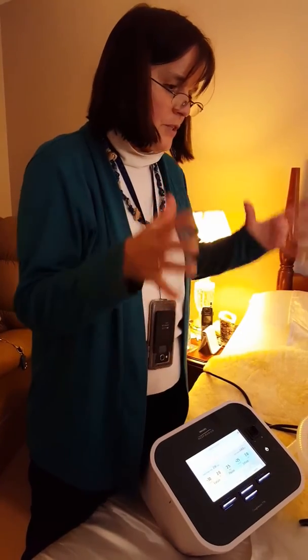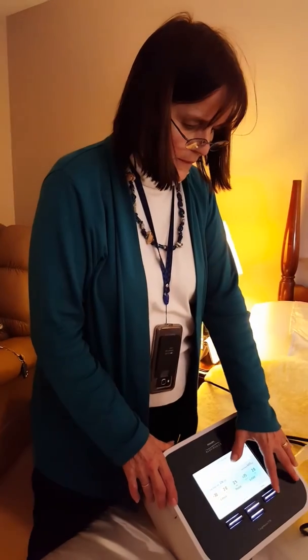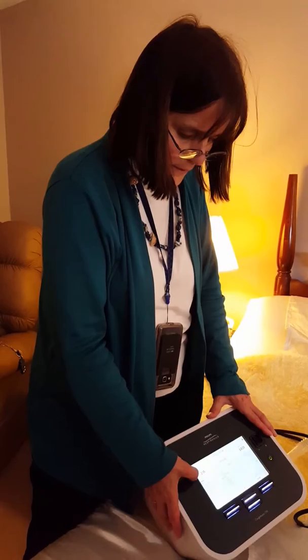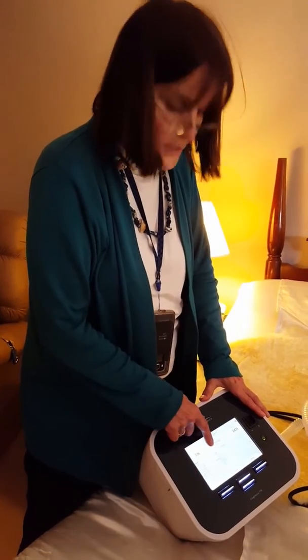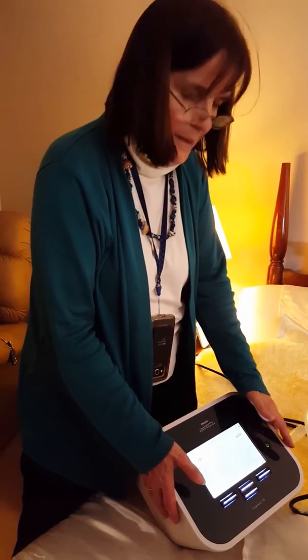They usually like you to do a total of 12 to 16. Now I have different settings in here — there's preset one, two, and three. You're gonna use one and two; I have all three set, but I think those are the ones.